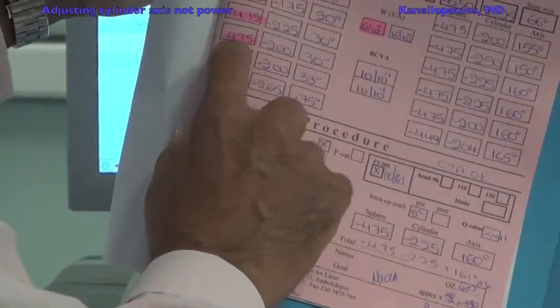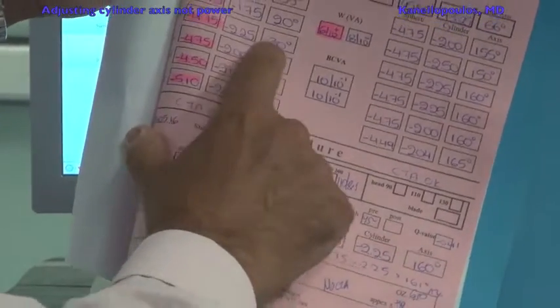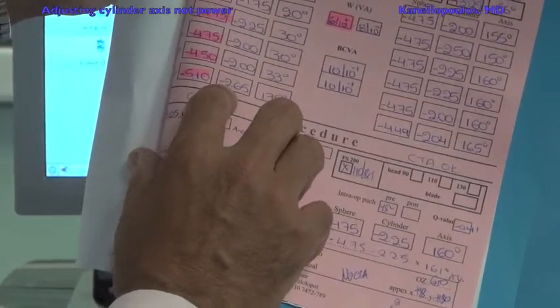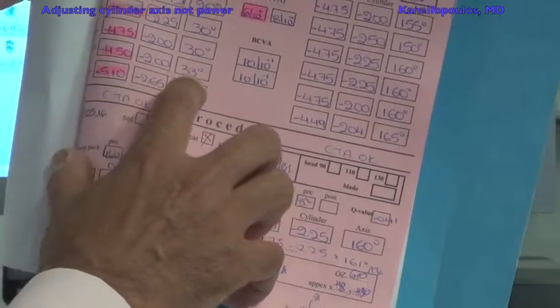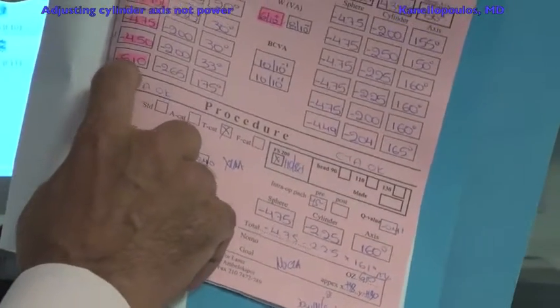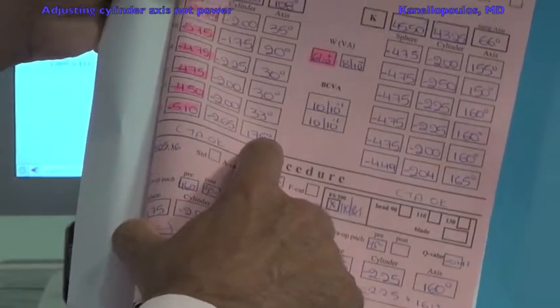The cycloplegic refraction is minus 4.75, minus 2 at 30, almost the same as the dry manifest. The auto refraction after cycloplegia is minus 4.5, minus 2 at 33. And very importantly, the wavefront measurement is minus 5, minus 2.65 at 175 degrees.